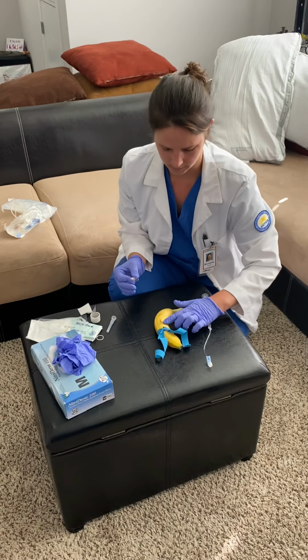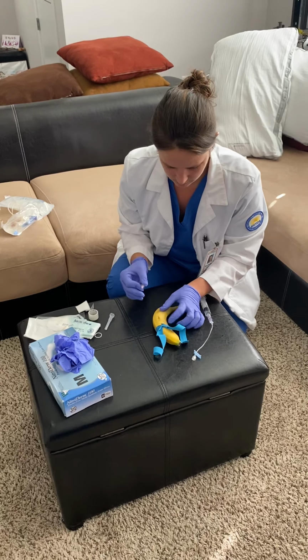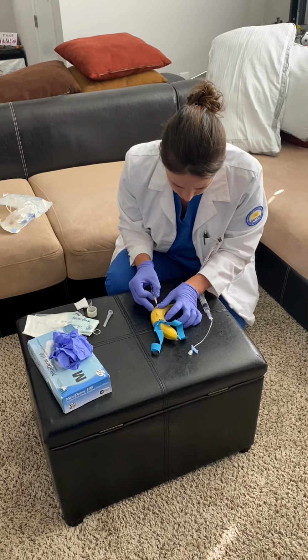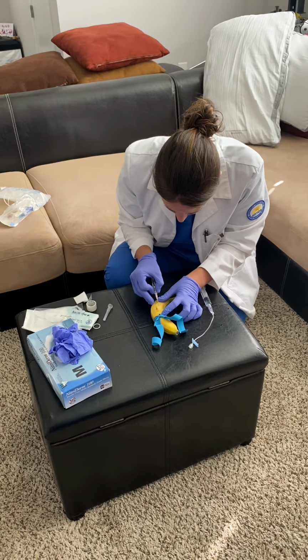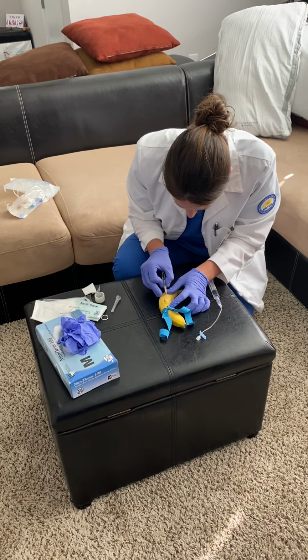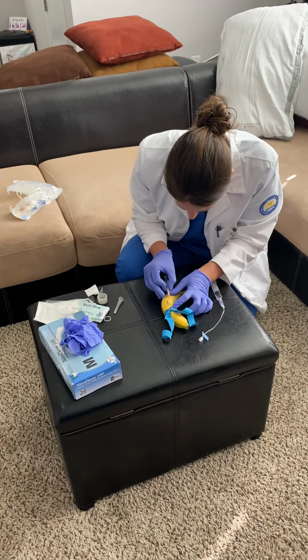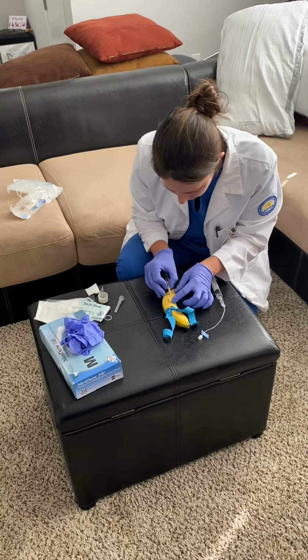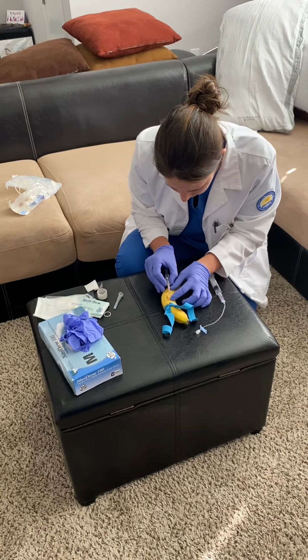You want to go ahead and anchor your vein at about a 10 to 15 degree angle. You're going to gently glide in. And once you see blood return, make sure the vein stays anchored.